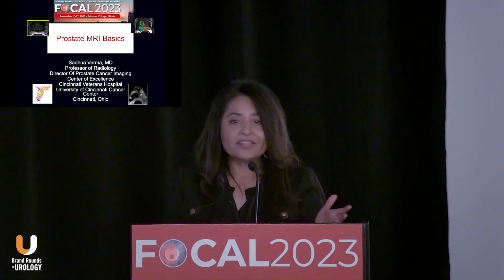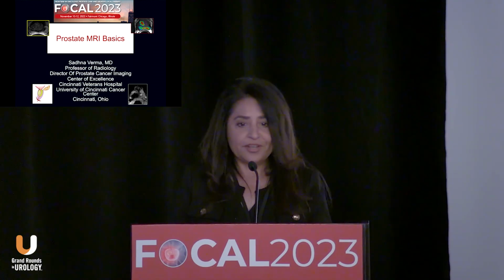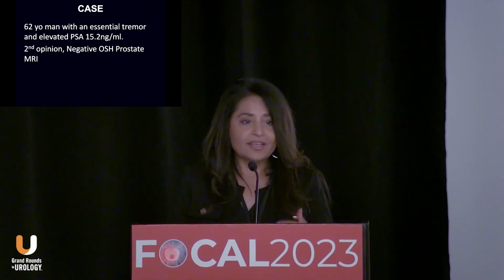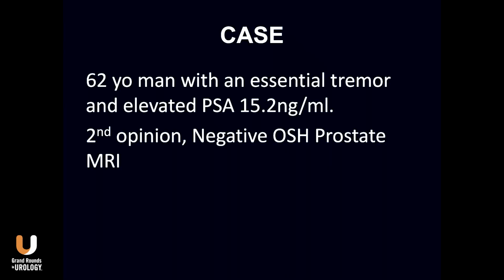So apologize, this is going to be very basics of MRI, so I hope I don't bore anyone, but good refresher. And you can imagine in the space of focal, MRI holds a very high space. So let's just start out with the case.